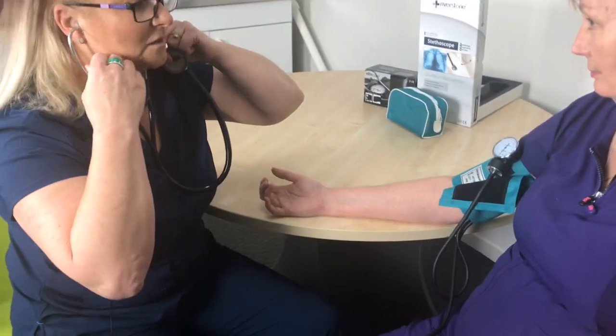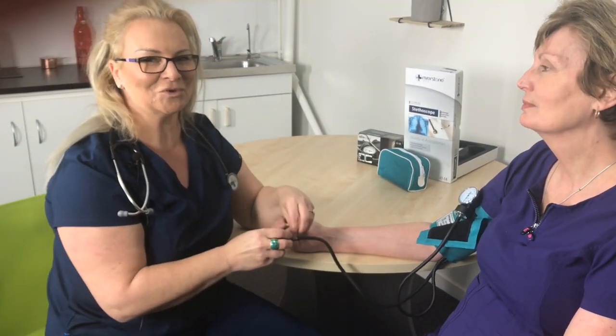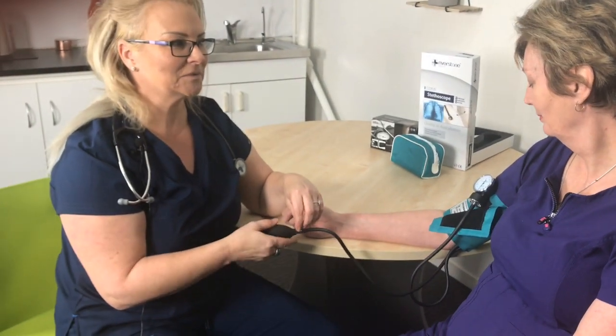That was about 140 on 70 — that's a little bit high. It's always important to tell your patient what the recording is. Some patients will know exactly what the numbers mean; some will need a little bit more explanation.